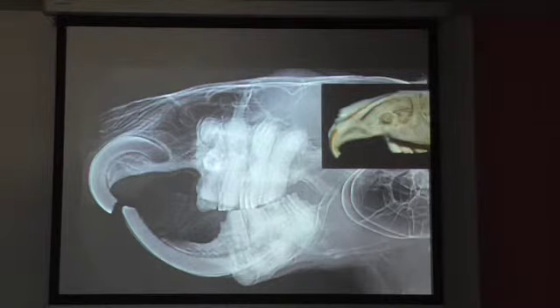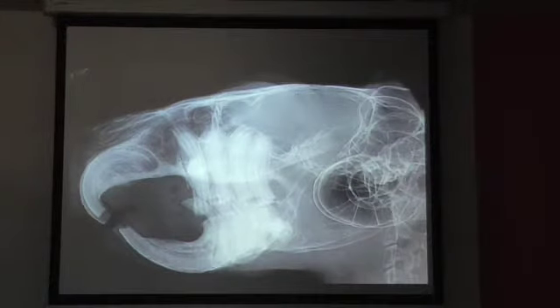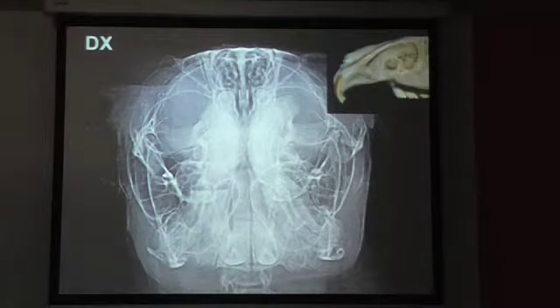Yeah, just remember my fingers with all this oval stuff on it. Direction and shape. Again, huge elongation. Sometimes we see the elongation which is really growing close to you, and there is even huge dysplastic changes of the incisors. This is the rostrocaudal view of the same chinchilla.